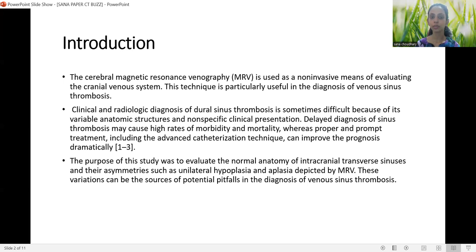The purpose of this study was to evaluate the normal anatomy of intracranial transverse sinuses and their asymmetries, such as unilateral hyperplasia and aplasia, as depicted by MR venography. These variations can be sources of potential pitfalls in the diagnosis of venous sinus thrombosis.